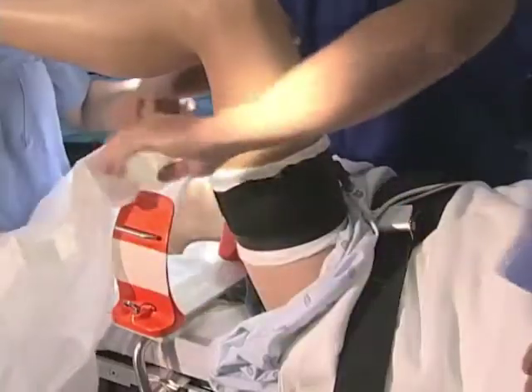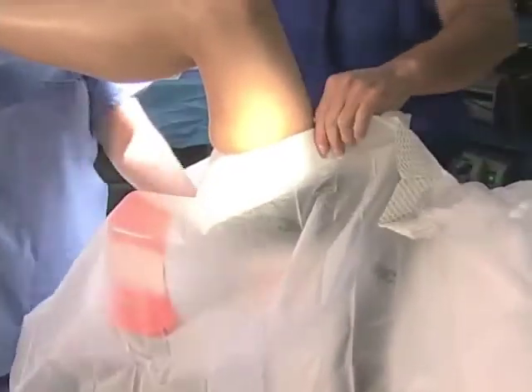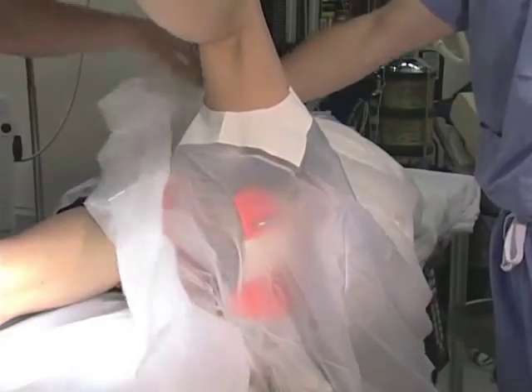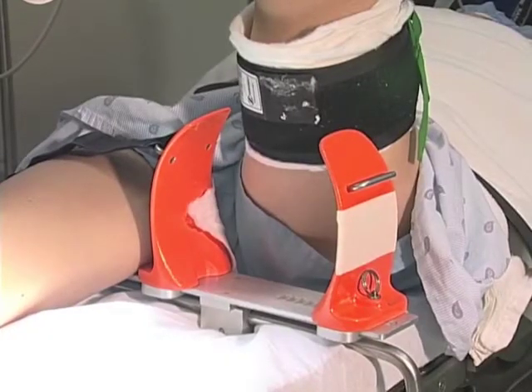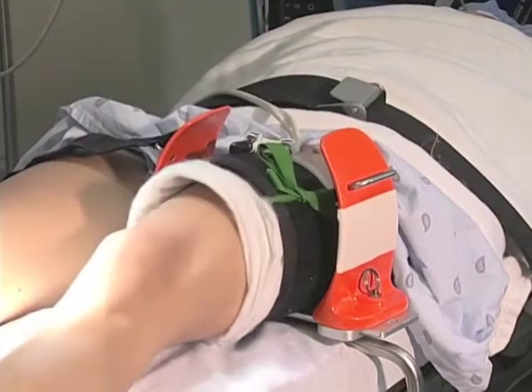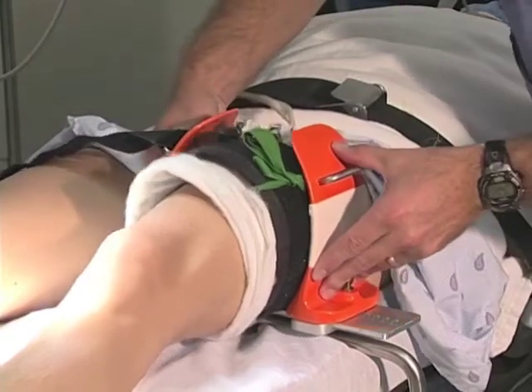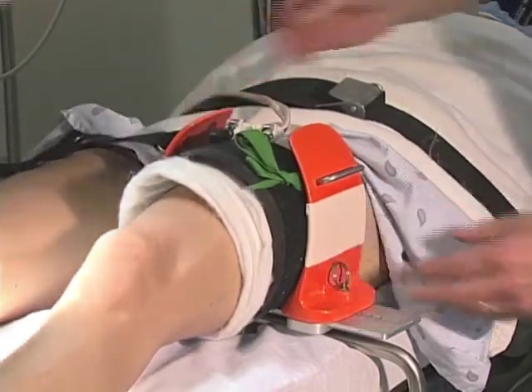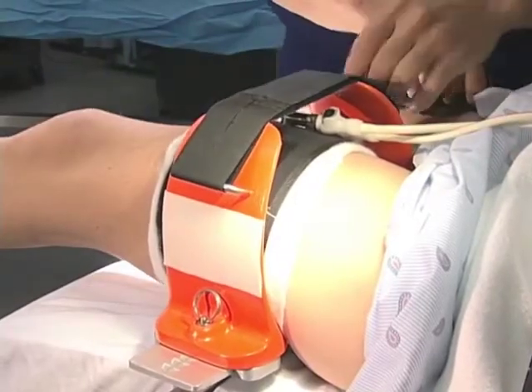A plastic drape is affixed to the patient's thigh so that the preparation solution does not drip up and under the tourniquet. After the tourniquet is placed, the leg is lowered into the circumferential leg holder. The leg holder is squeezed closed, the straps are placed, and the foot of the bed is lowered.